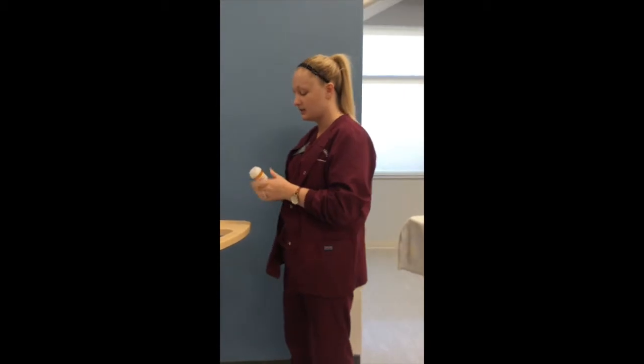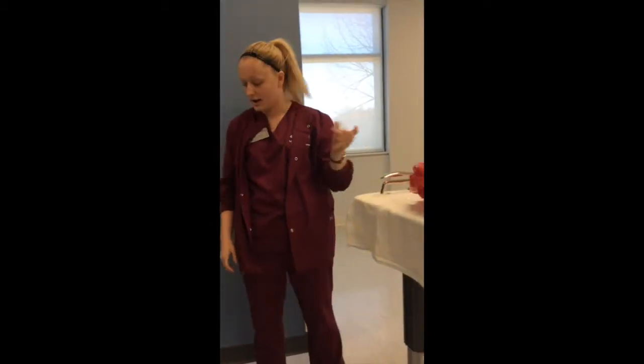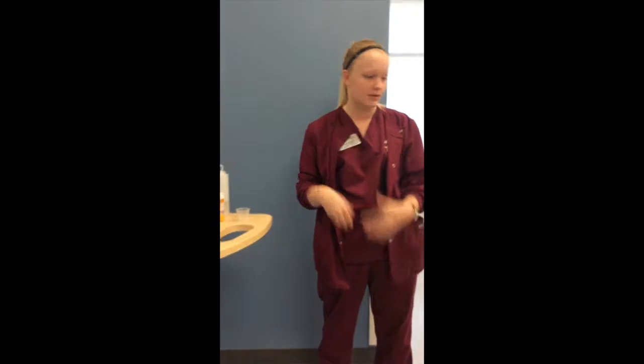So after I've got all my supplies gathered, I'm going to need an irrigation syringe, a pill crusher, a cup, some water, and the medication. I'm going to gather all my supplies and get ready to go to the room. However, like I said, if there's a feeding, I'm going to go to the room, check their name and date of birth and everything, clamp their feeding for 30 minutes, and come back with this medication. So say I've already got the feeding clamped.